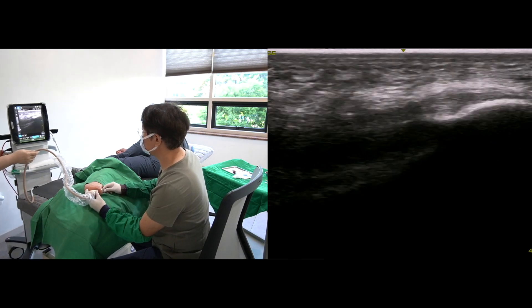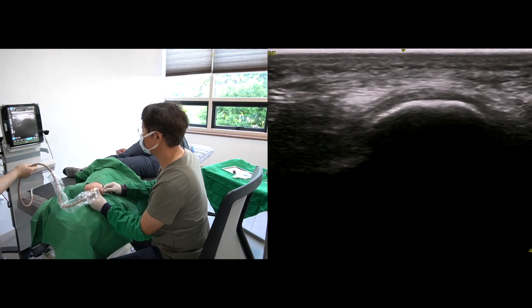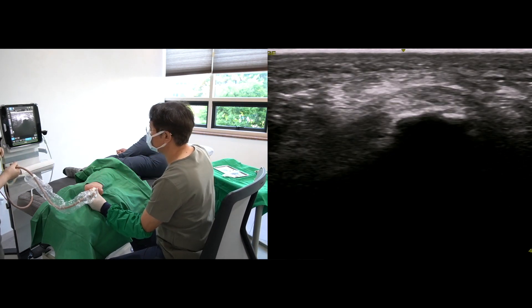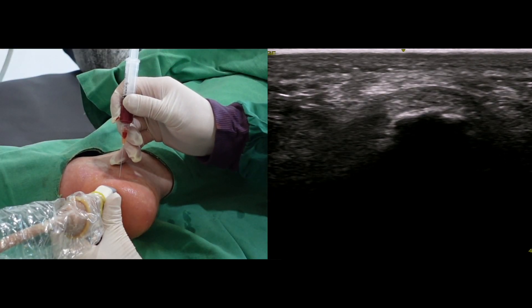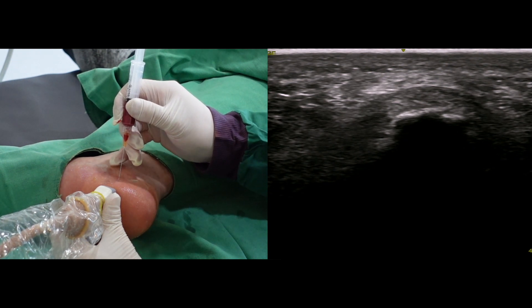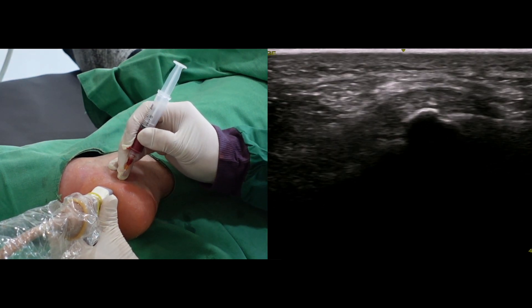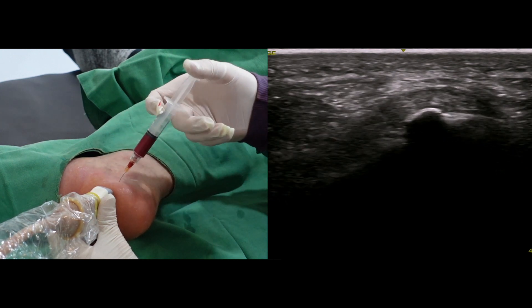Let's watch the scan of the plantar fascia. It is a short-axis scan image. I will go in using a short-axis in-plane technique. I already waited enough time to activate the local anesthetics, so my patient will be relaxed and comfortable.